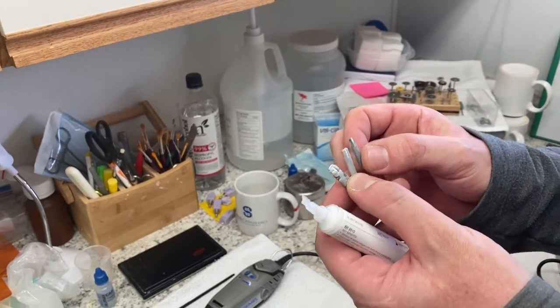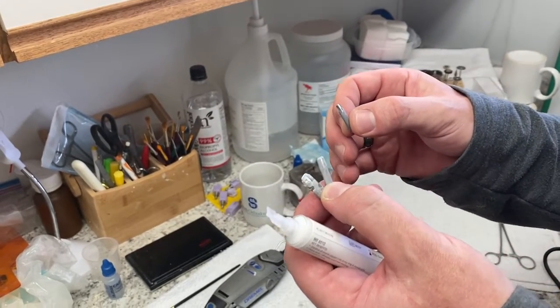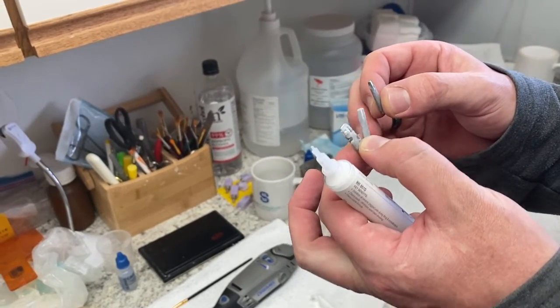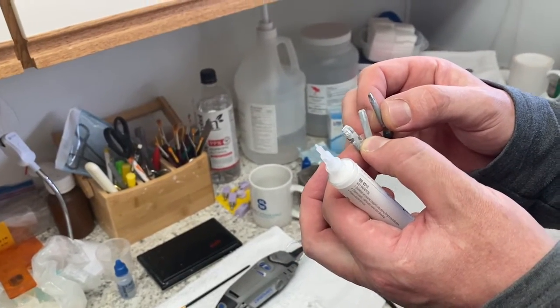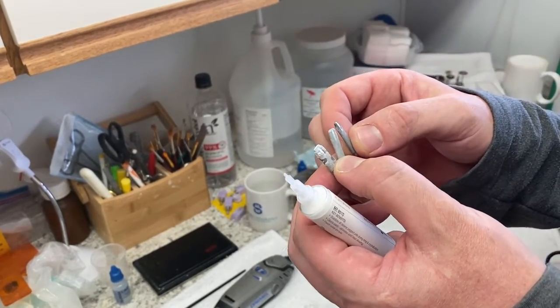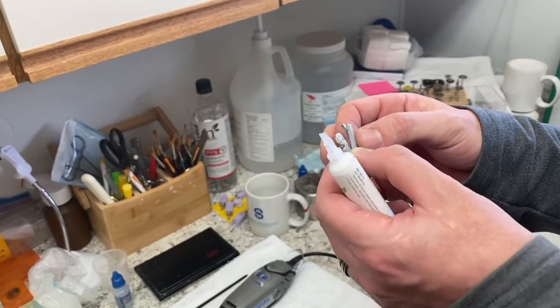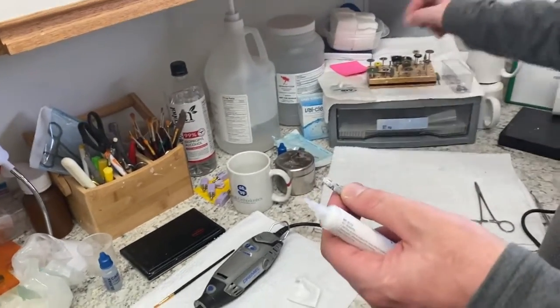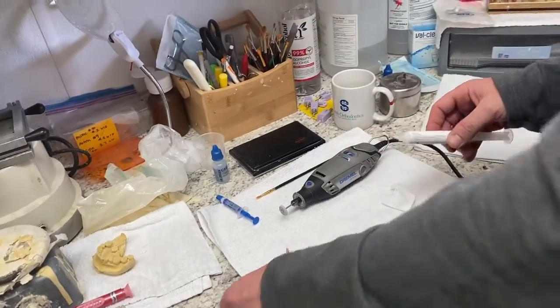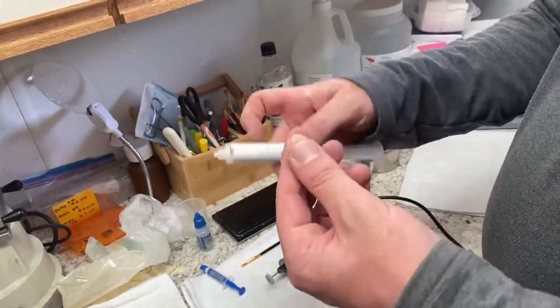What you don't want is for that peg to touch your margin, because the peg expands and contracts while it's going through the heating process. If you have it wedged against your margin, then you're going to crack your margin out of your crown. Okay. So since we're doing a molar crown, the risk of that is very, very low. Those molars are big. They give you some space. And that's a small molar.